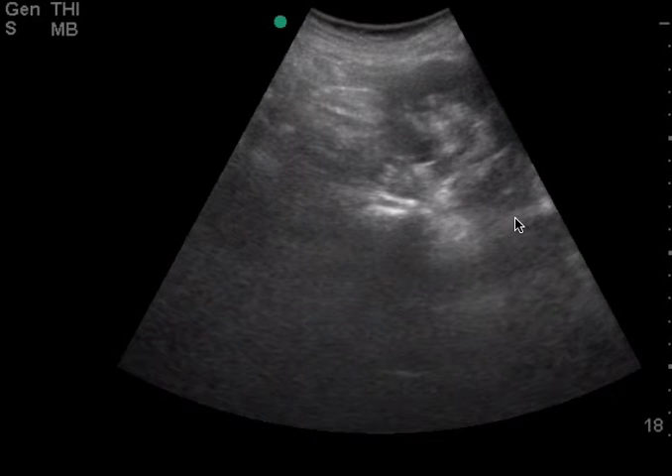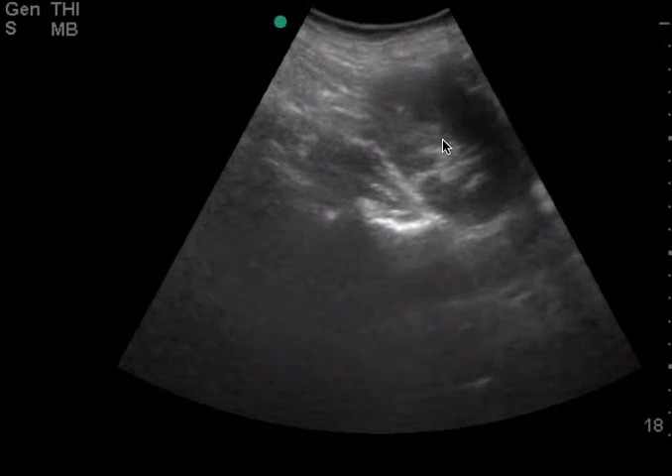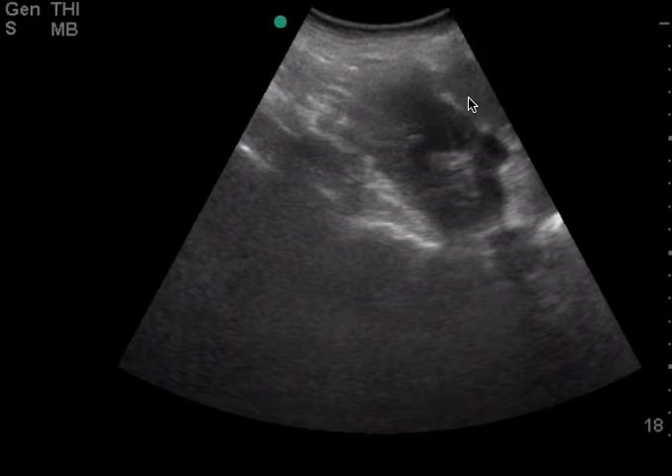Now we've moved up to the left upper quadrant. You can see the kidney here, and then you see the spleen come into view. The probe is backwards — the indicator here is towards the patient's feet, and so you want to reverse it so it's towards the patient's head.